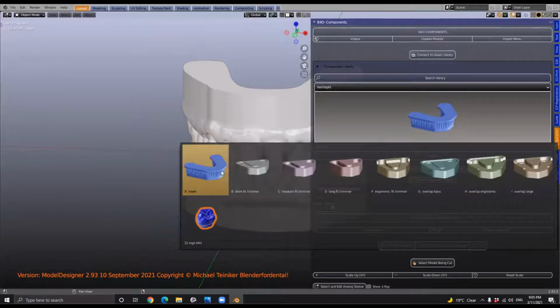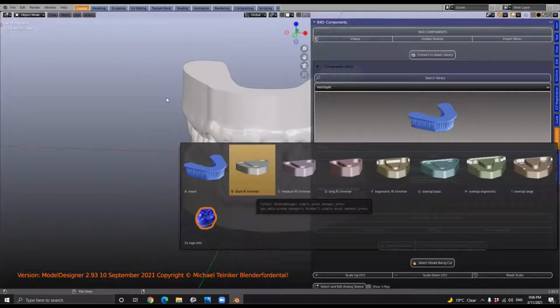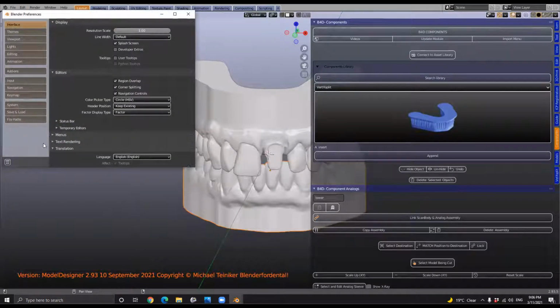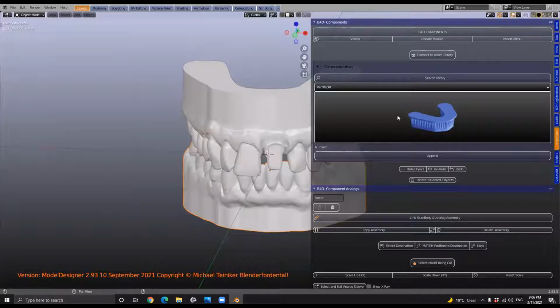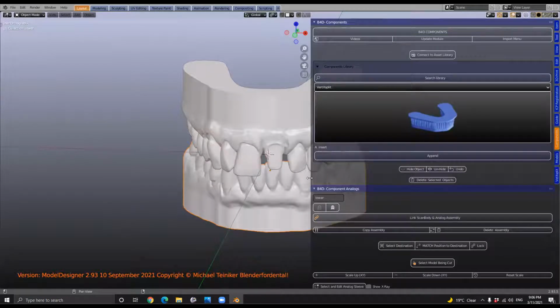Yeah, so the blue one is the sprocketed or serrated insert that fits into the plastic injection mold. Next to that, we've got a series of different trimmers or cutting tools. You can lasso cut the model down so it eventually fits onto the insert, but we figured we need a quicker way. So we've developed those cutting tools. If you've got larger models, it's a very quick procedure to trim them down so that we can then unify the model directly onto that serrated insert. So Mike will demonstrate, maybe just grab one of those and cut the model down and then unify it to it.